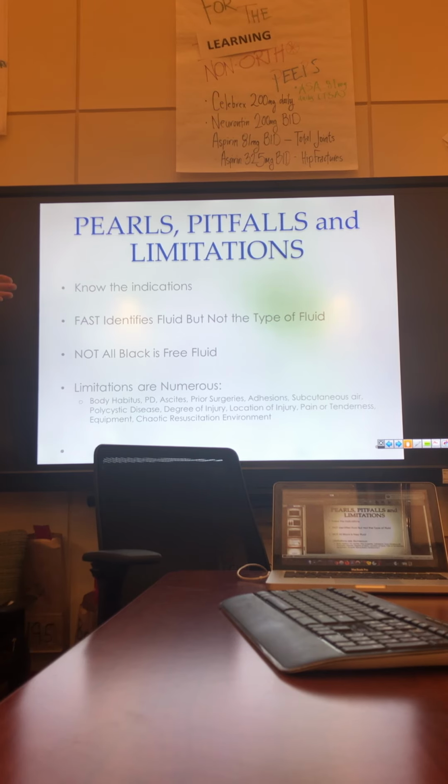Not all fluid is blood. Not all black is blood or fluid. It could be bowel, or fluid within a vessel, etc. And you can see the numerous limitations that we talked about. So, anyway, any questions about any of this stuff?